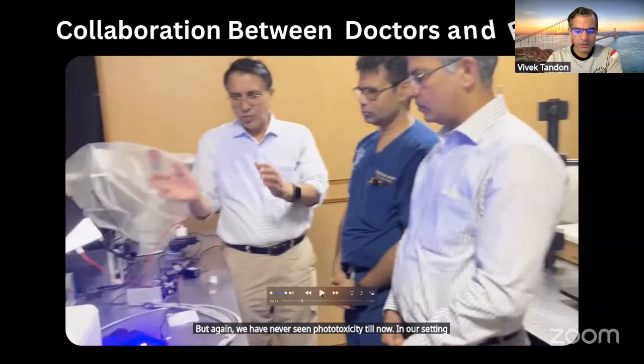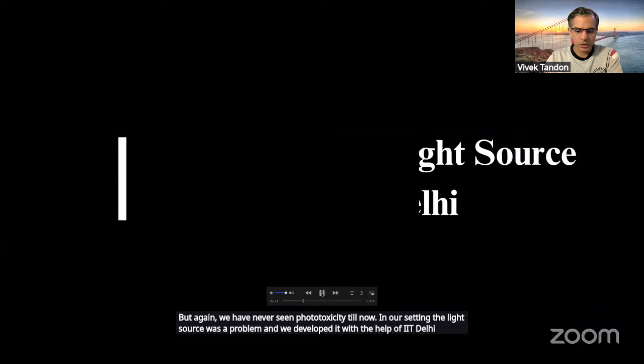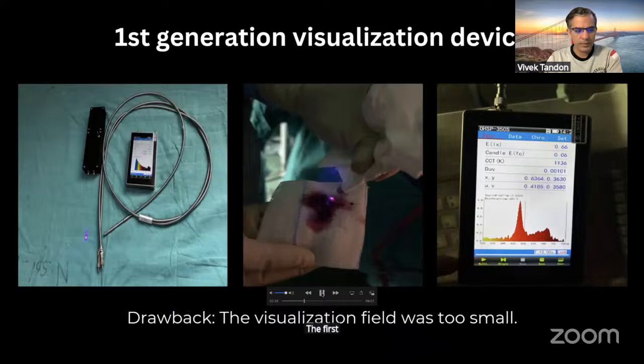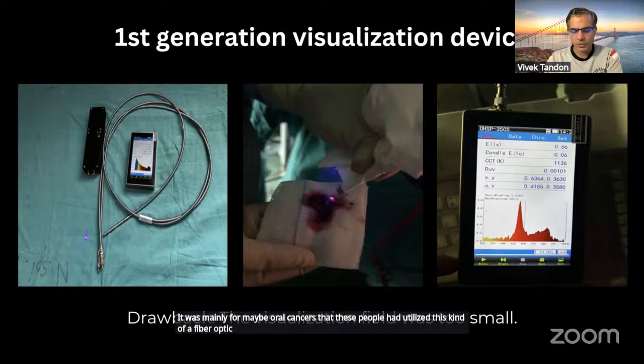The light source was a problem, and we developed it with the help of IIT Delhi. The picture that you just saw was of Professor D.S. Mehta. He's again a very experienced person from the field of optics. The first generation device that we manufactured was an optic fiber, and we could use spectroscopic analysis also with this. But the problem that we realized was the area that could be visualized was very small. It was mainly for oral cancers that people had utilized this kind of a fiber optic device, but it wasn't useful for us.